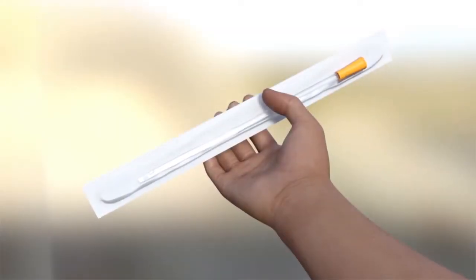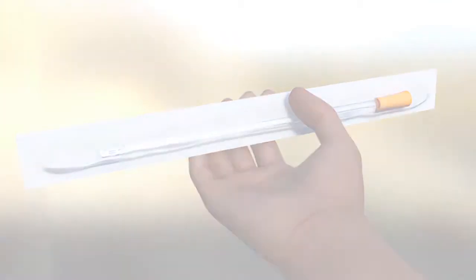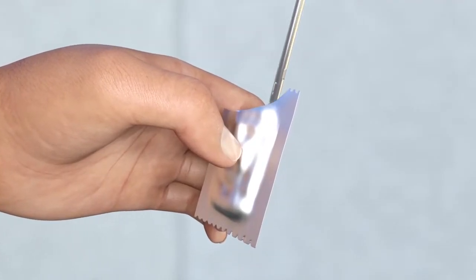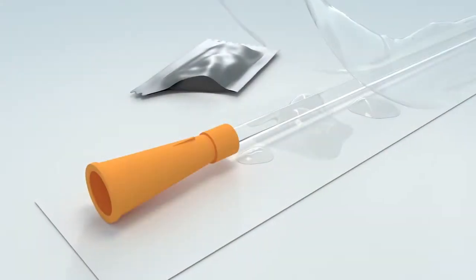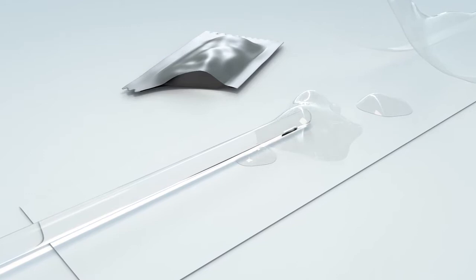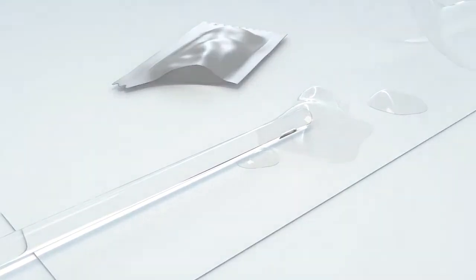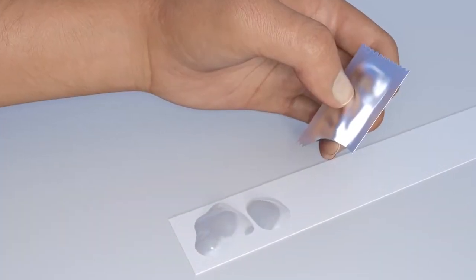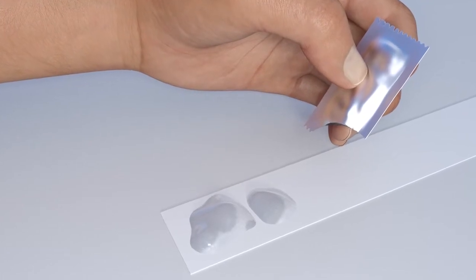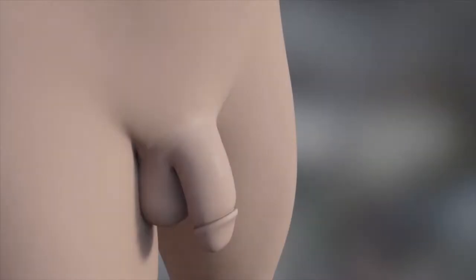Now you're ready to lubricate your catheter using water-soluble lubricant. There are several ways you can do this. Option one: tear a corner off the lubricant sachet and dip the catheter tip into it. Option two: peel the pack back a little way and then squirt the lube into the peel pack — this will coat the catheter as you remove it from the pack. Option three: tear open the pack and remove the catheter, squeeze lubricant onto an exposed part of the inside of the peel pack, then dip the catheter into the small puddle of lubricant.